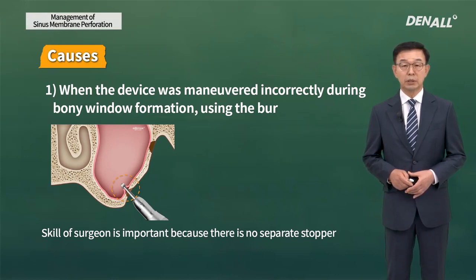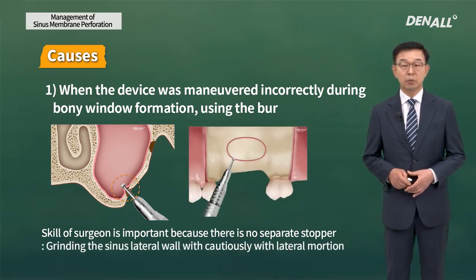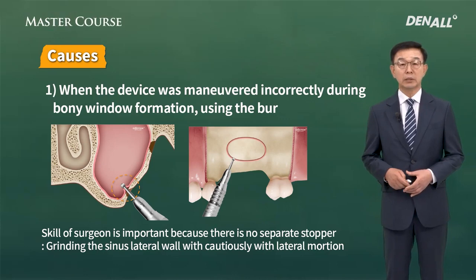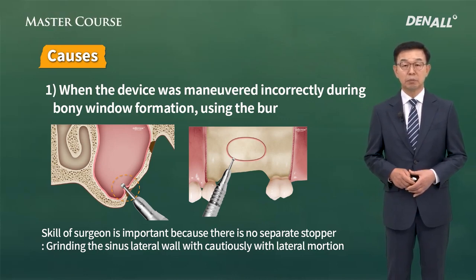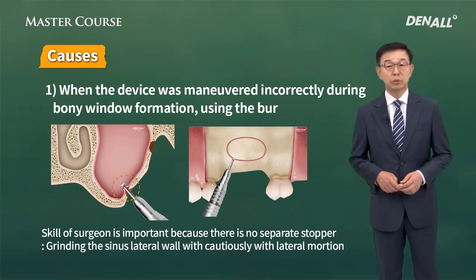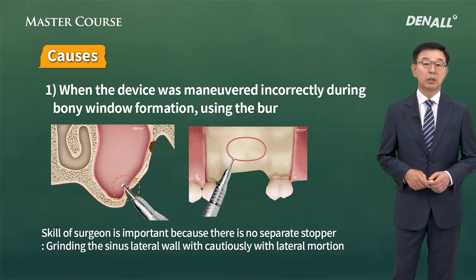When you do lateral approach using burr, you need to do side motion, lateral motion, and grind the bone consecutively. You need to pay a lot of attention as you do this and as you master this technique. Next, perforation can occur while sinus lift is done.